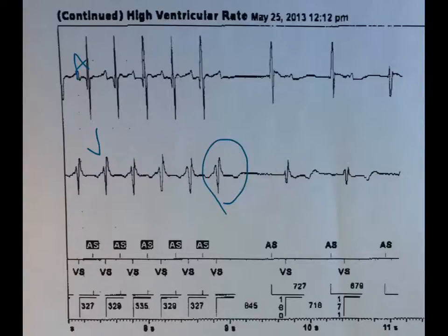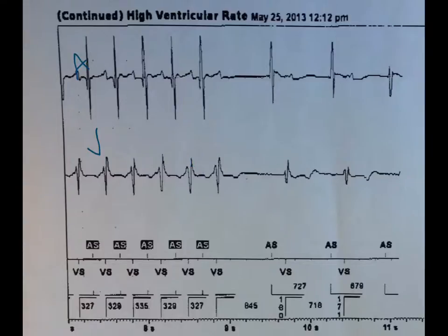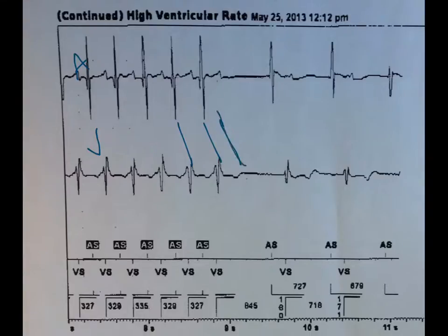If this were ventricular tachycardia, and this A is coming from there, there should be an A here that is coming from there — right here. But there's not. So is it more likely that this A comes to here, this one to here, and since there is no A there is no V? Or is it more likely that the tachycardia terminates at the same time that the V doesn't conduct up to the A?